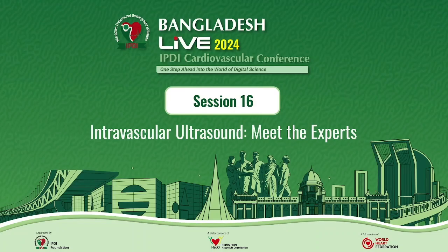IVUS is nowadays an integral part of our cath lab. So the knowledge of IVUS is very much essential.